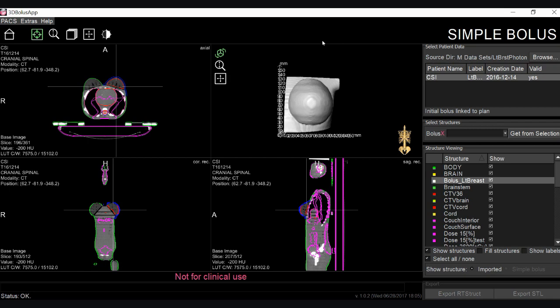Once the user selects the simple bolus module from the home screen, they are prompted to select browse and navigate to the folder housing the patient information, which I have already completed. 3D Bolus then imports the patient's CT scan acquired during their CT simulation into all structures contoured in the treatment planning system, including tumor volumes, organs at risk, and any bolus objects.